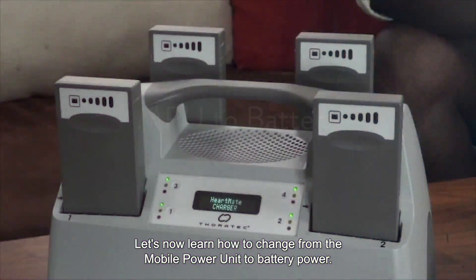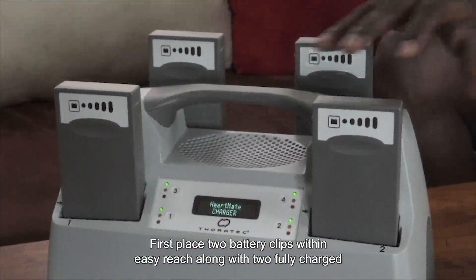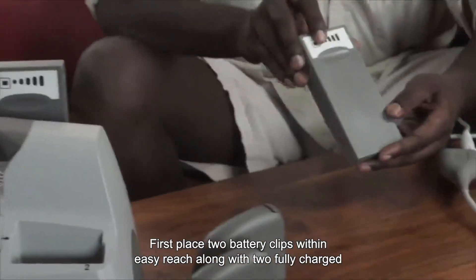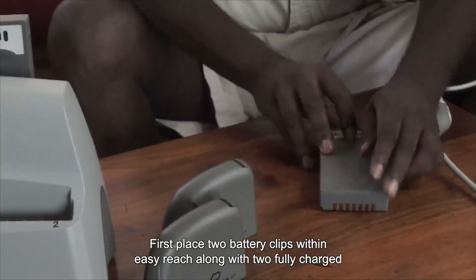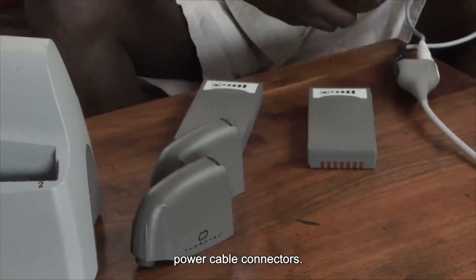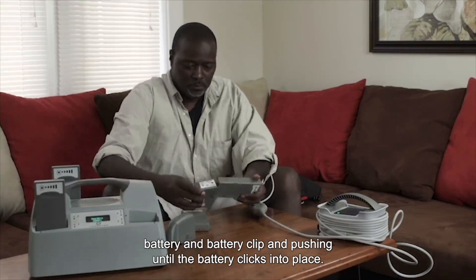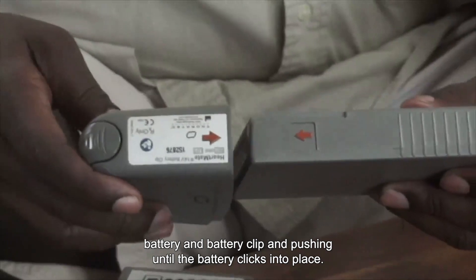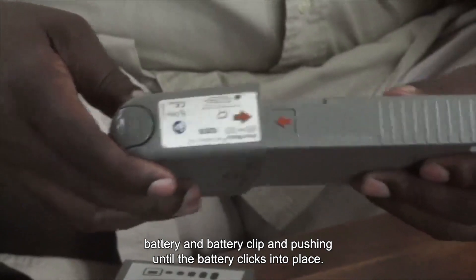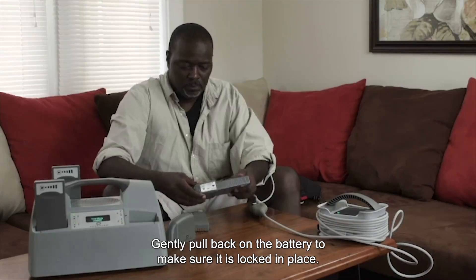Let's now learn how to change from the mobile power unit to battery power. First, place two battery clips within easy reach along with two fully charged batteries and the white and black mobile power unit system controller power cable connectors. Place the first battery into a battery clip by lining up the arrows on the battery and battery clip and pushing until the battery clicks into place.